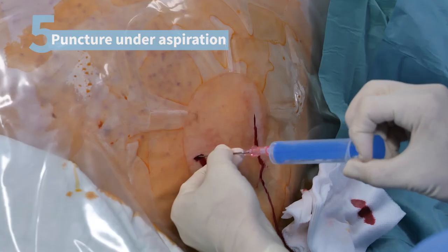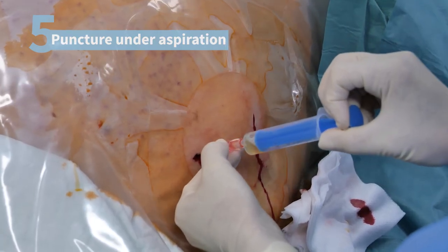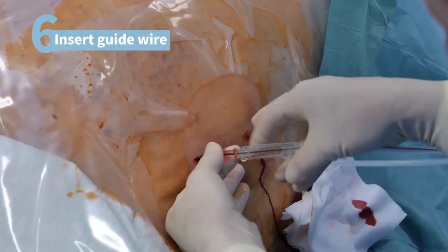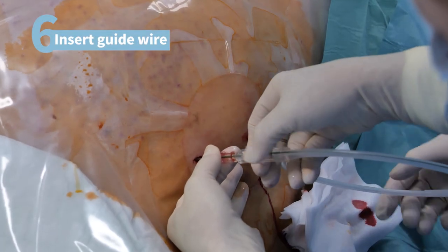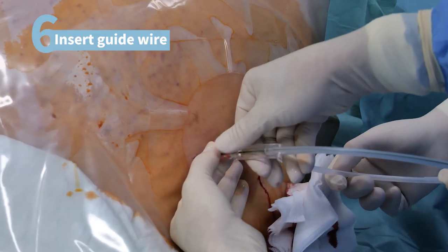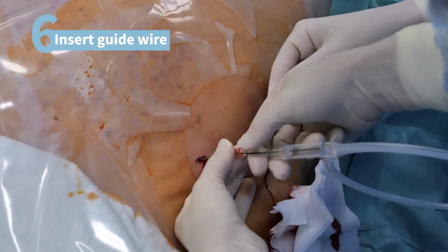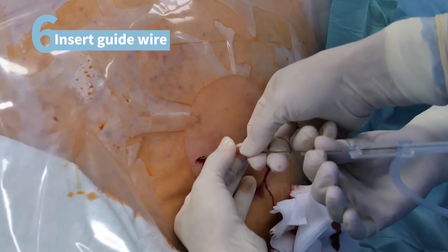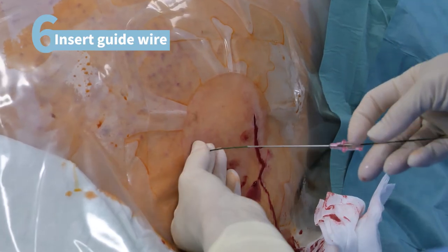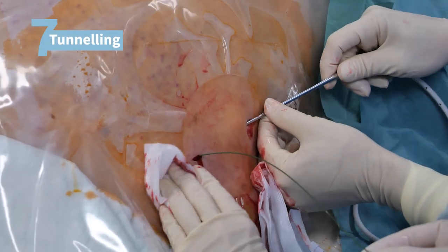Now, the cannula is carefully advanced into the peritoneal cavity while applying regular suction. The Seldinger technique is used for this. It is essential to firmly secure the wire in place so that it does not accidentally dislocate or come loose. The cannula is carefully removed over the wire and the subcutaneous tunnel is made using the tunneler.